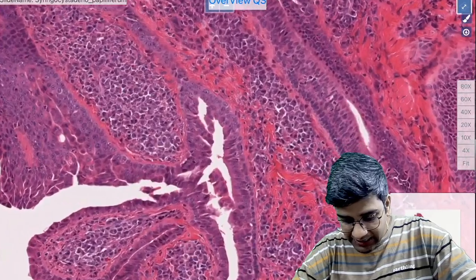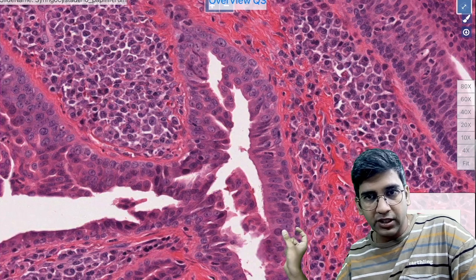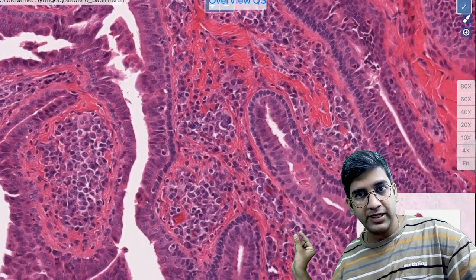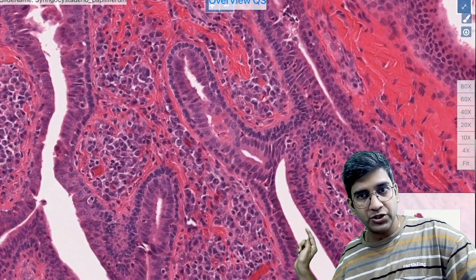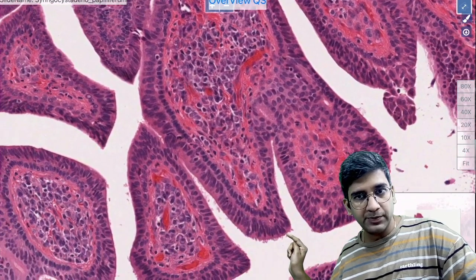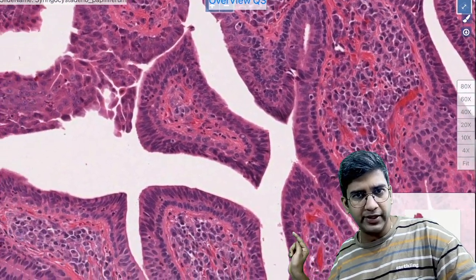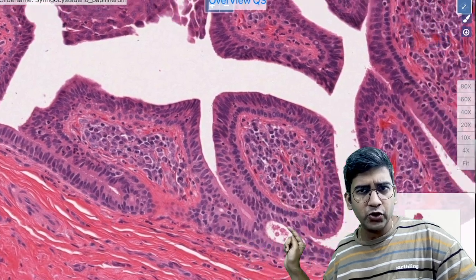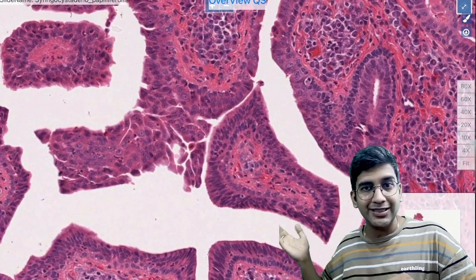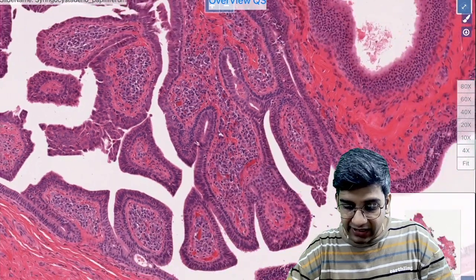If you look at the classical double layered epithelium, you'll have good amount of columnar epithelium here and there's a tiny cuboidal epithelium. That's how the entire papillary projection will be. Wherever you go along the papillary projection, the double layering of epithelium will always be maintained. You'll have one columnar epithelium here, multiple tiny things, and also a cuboidal epithelium here, right? Wherever you go, these are also the papillae which have been cut in half like this so that you can see the cut surface here. This also has the outer epithelium, inner epithelium, right? That's characteristic of the lesion.